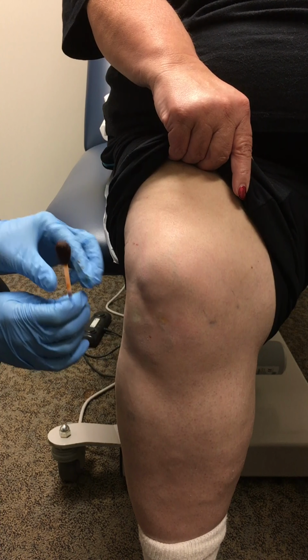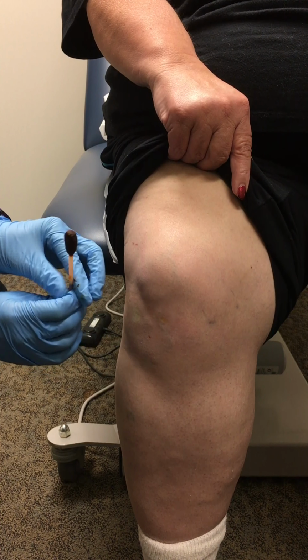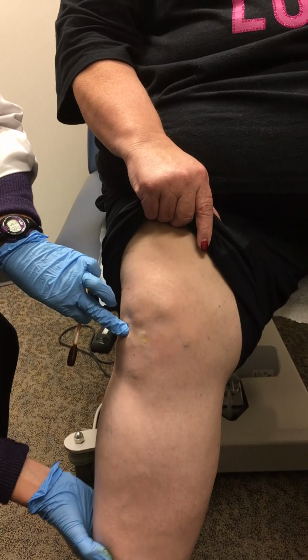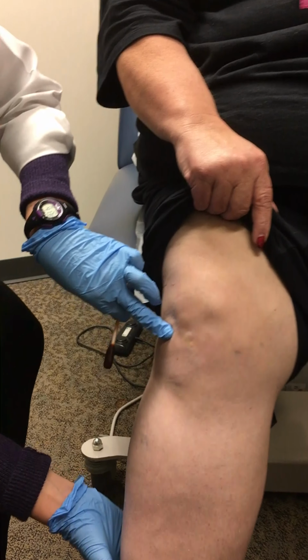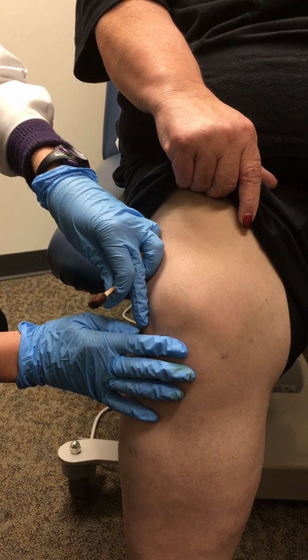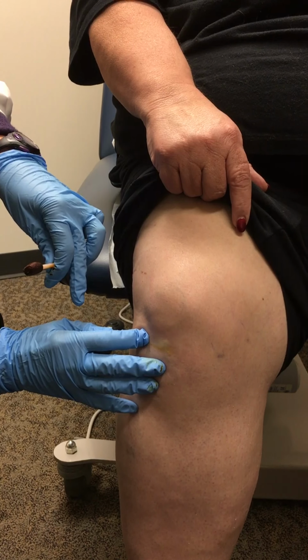If you're having trouble feeling that on the patient, you can have them move their knee back and forth a couple of times, and that can help find the bottom of the patella and kind of feel where that joint moves. So check that one more time.